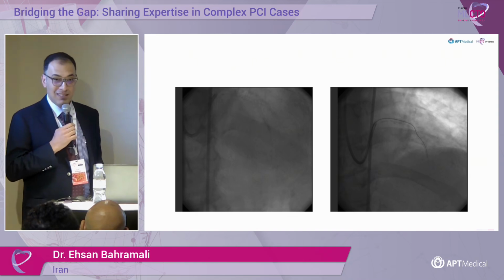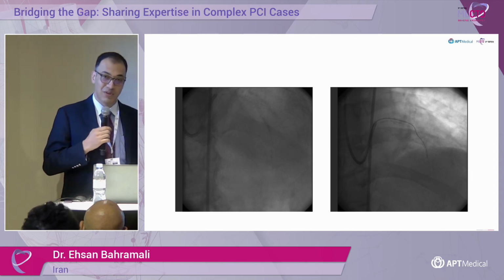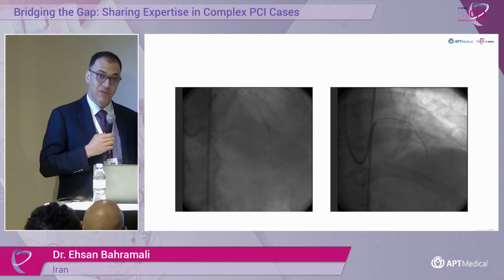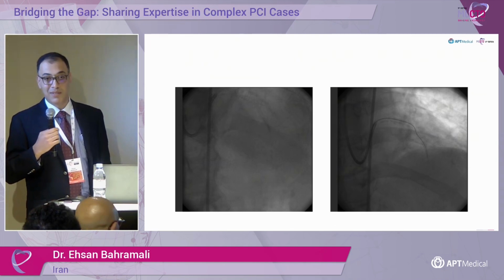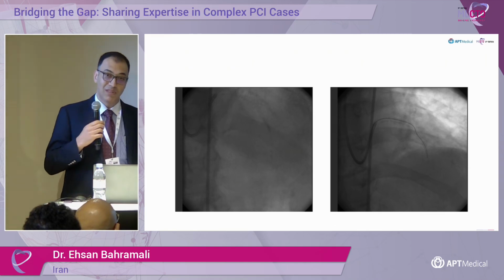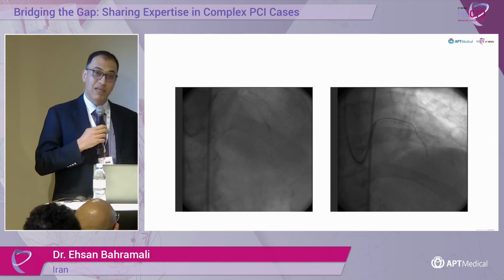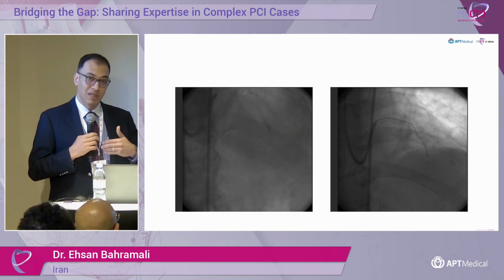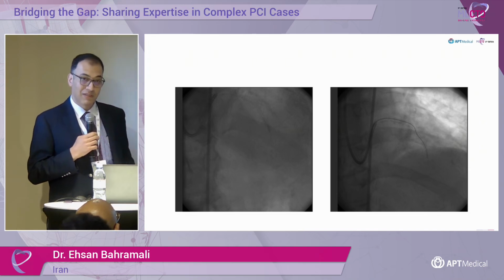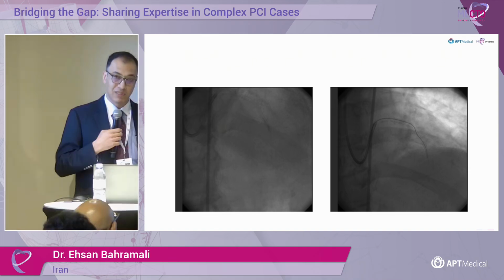We thought by passing the wire in this severely calcified and critically stenosed anastomosis site, the flow of the Lima to LAD would decrease and the patient would become unstable. And if we couldn't manage to open the artery well and the balloons didn't work, we had no idea. We were prepared for rotablation, we were prepared for everything, but we thought if we couldn't manage to reach our balloons to the stenosed area of the Lima, maybe we wouldn't have enough time to treat the patient, and she might become unstable during the procedure. It was the main concern.